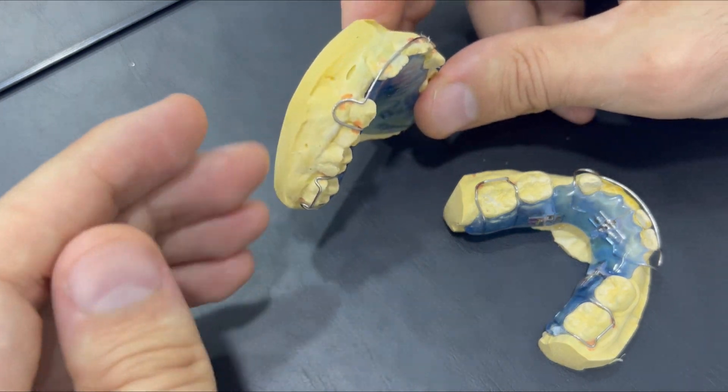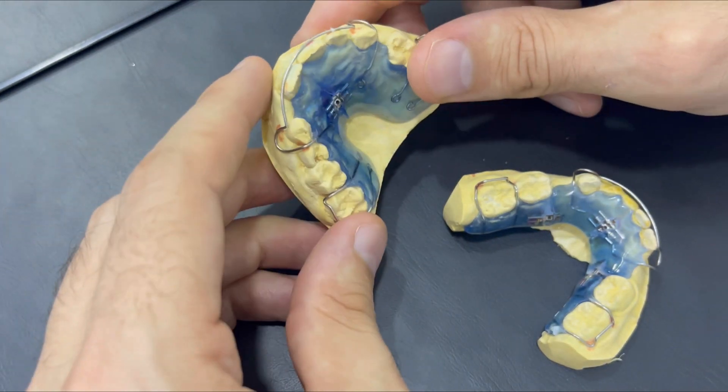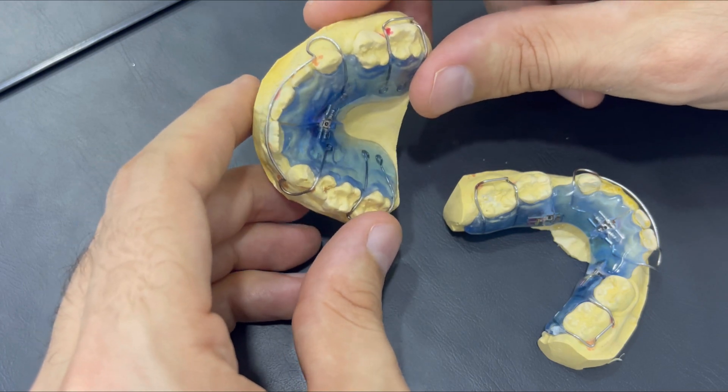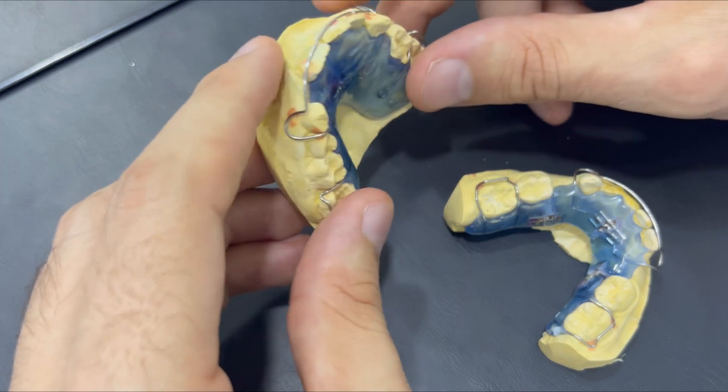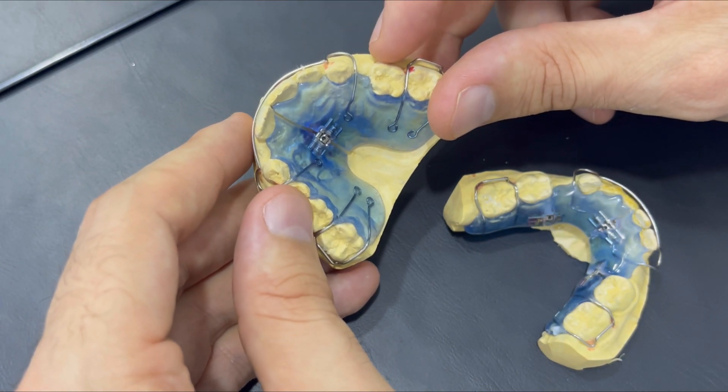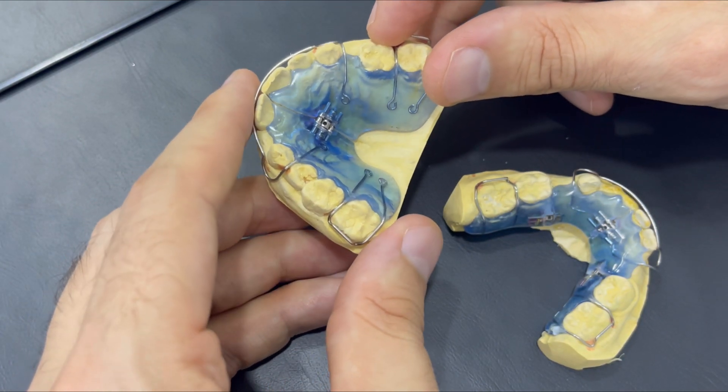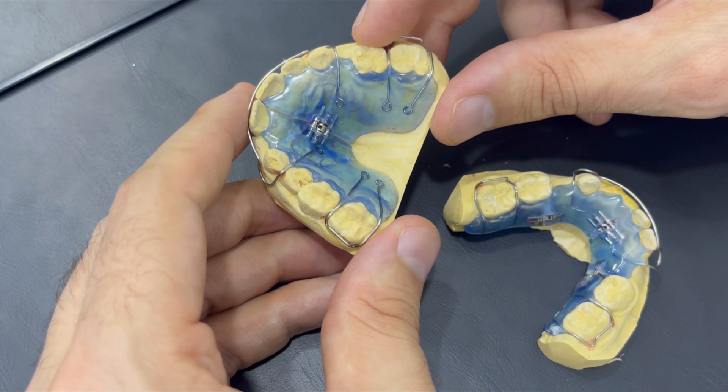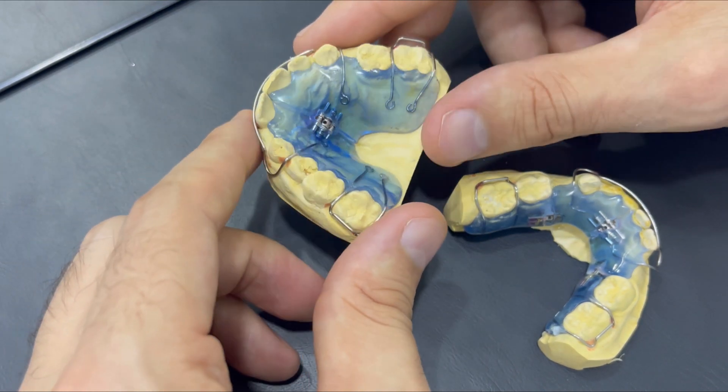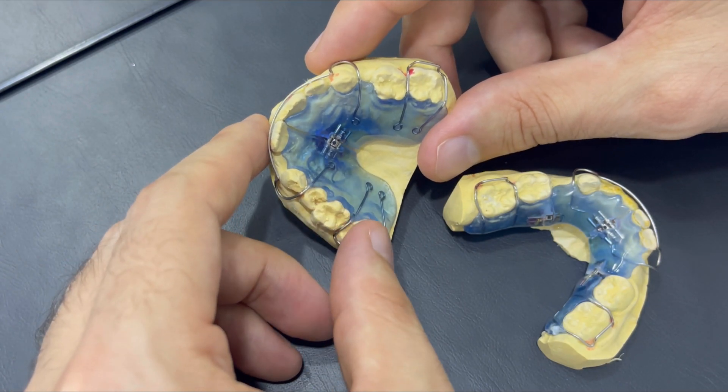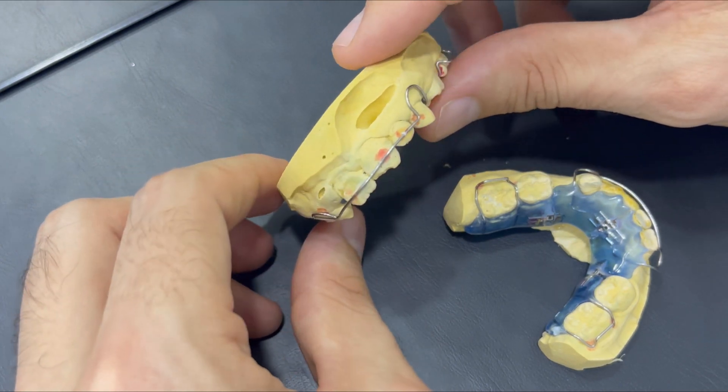So expanding the bone of the maxilla is the preferred goal, but it's minimum in the removable appliance. It's about 20% only with the growing patients. With adult patients, it's exclusively only dental expansion, so inclining the teeth outward.